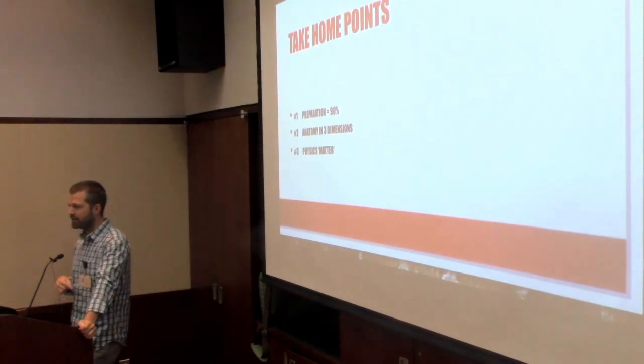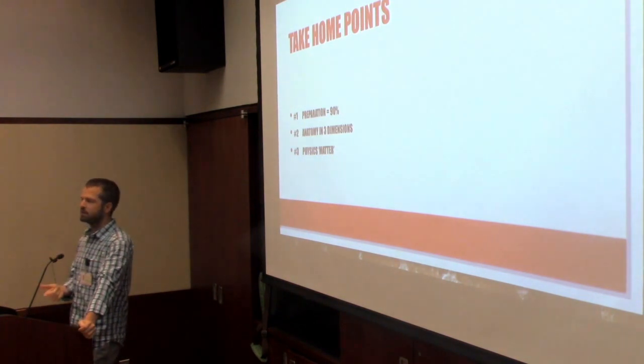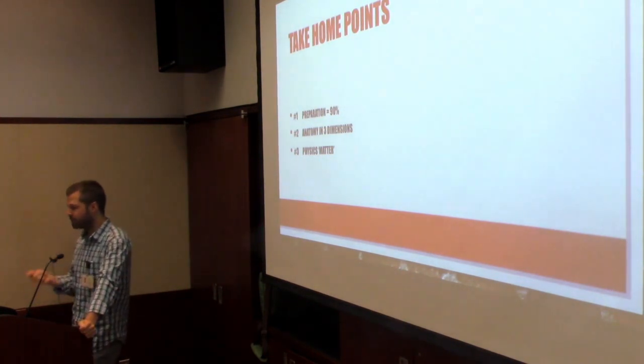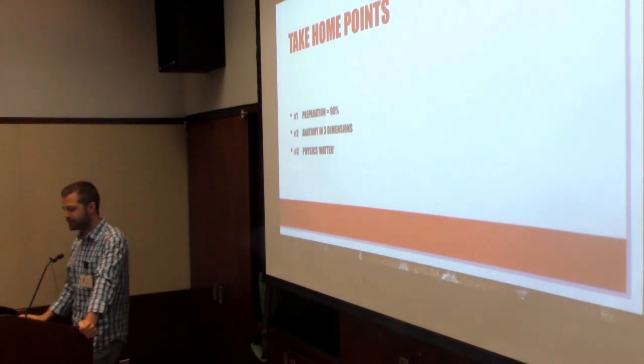And the other component of that is practicing. Either on a simulator, or when we have those noon conferences and we crack a kit, actually fiddle and play with the stuff. When you find the little tube and you're like, what the hell is this tube? Look it up. Find out what that tube does. See if it benefits you at all, or can you literally just take it out of the kit and throw it in the corner and have one less thing on your field.